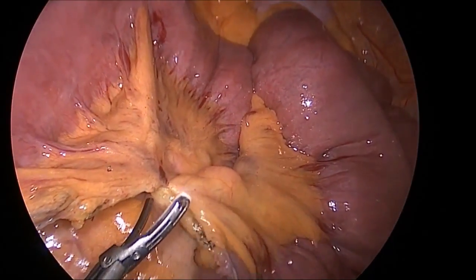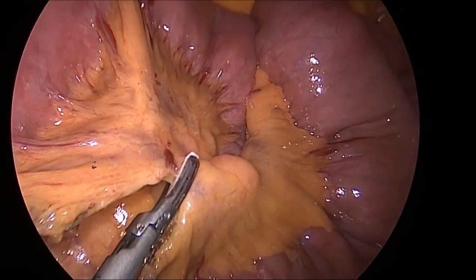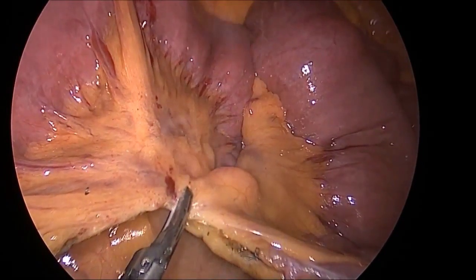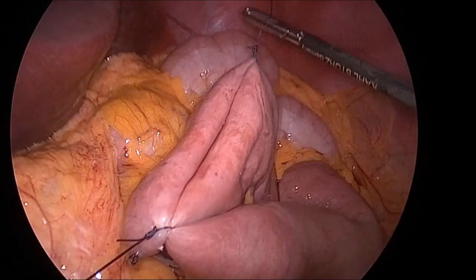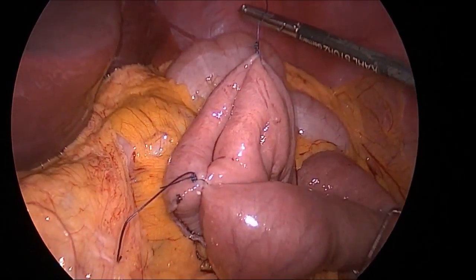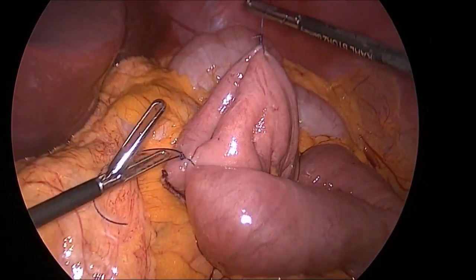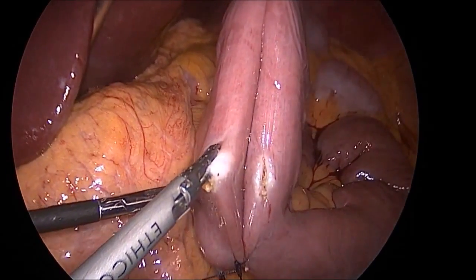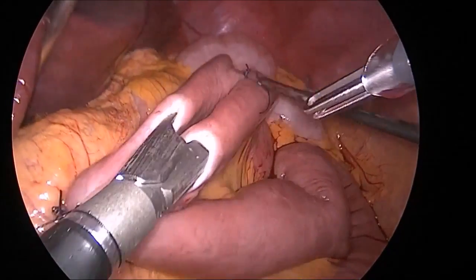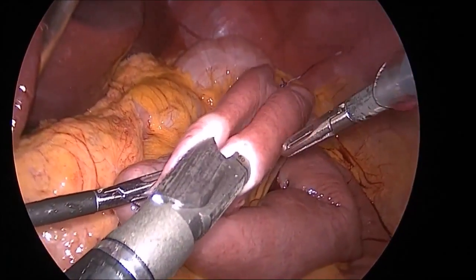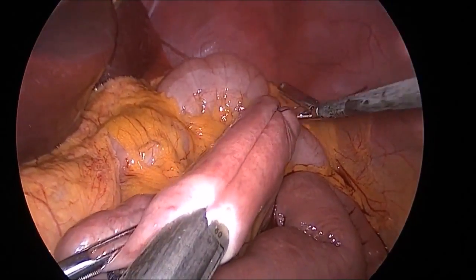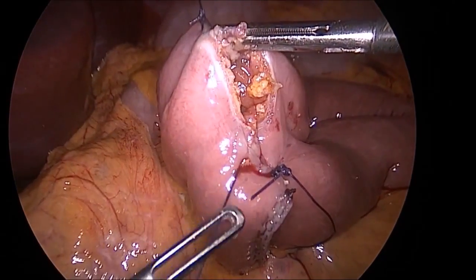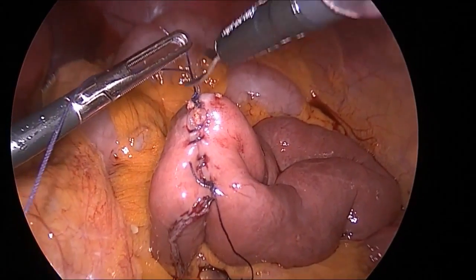The root of the mesentery was taken down using the harmonic device. Following that, both the Roux limb and the biliopancreatic limb were aligned side to side and sutured with Endo Stitch. Then two enterotomies were created using the harmonic. Through these, the jaws of the endo stapler with a white load were placed and fired to create the jejunojejunostomy. The common enterotomy was then sewn with absorbable suture in a running manner using Endo Stitch.